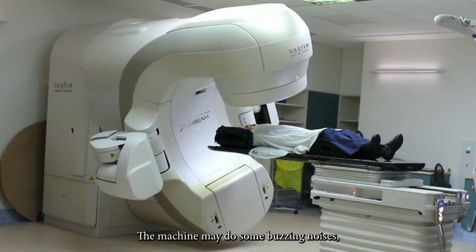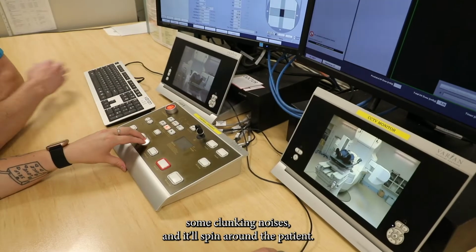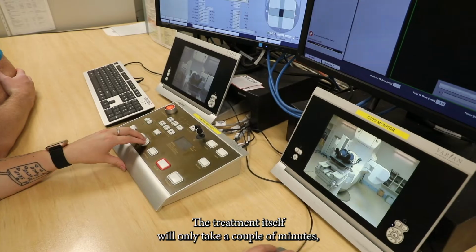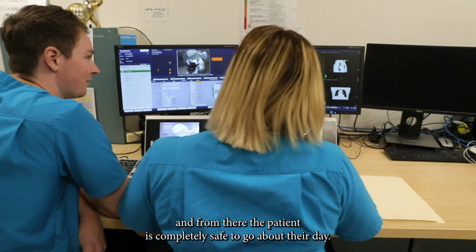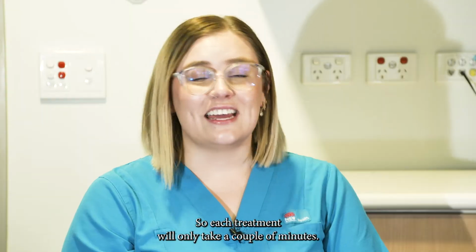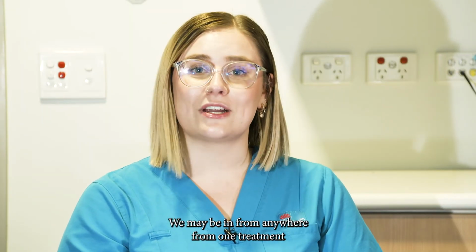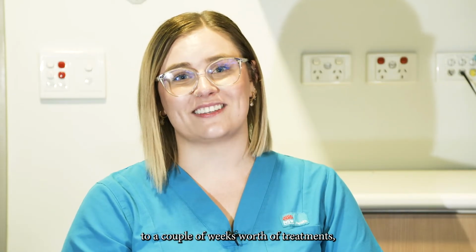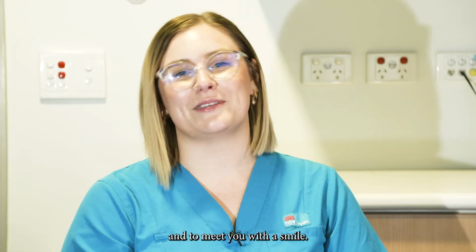The machine may do some buzzing noises, some clunking noises, and it'll spin around the patient. The treatment itself will only take a couple of minutes, and from there, the patient is completely safe to go about their day. So each treatment will only take a couple of minutes. You may be in for anywhere from one treatment to a couple of weeks' worth of treatments, but we're going to be there every step of the way to guide you along and to meet you with a smile.